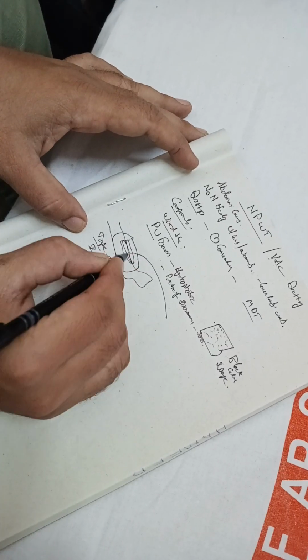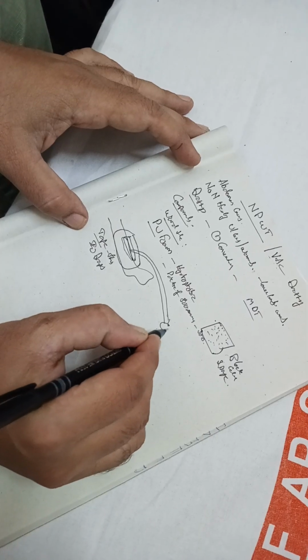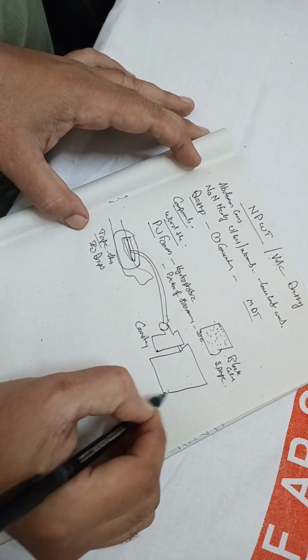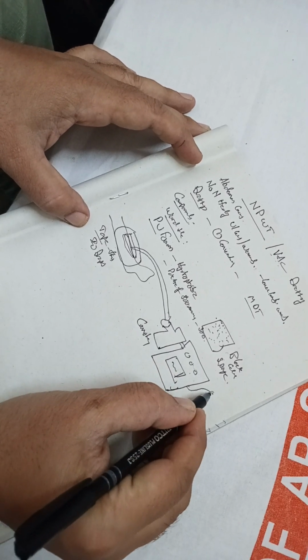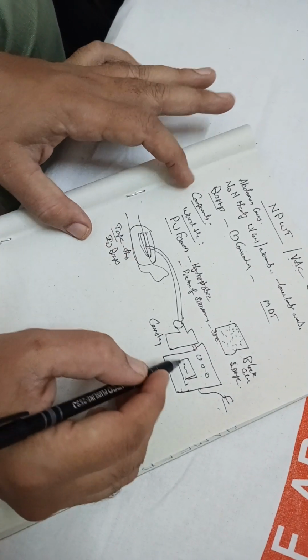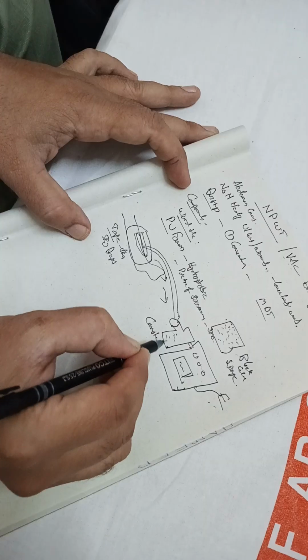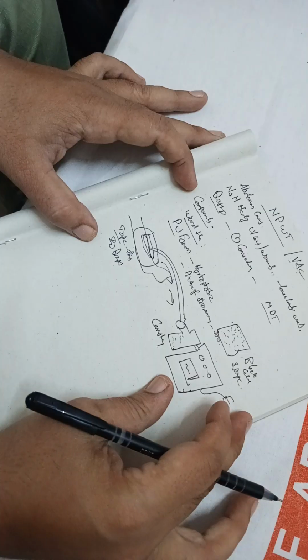Then there will be a connector, like a drain we connect. And this will go to a canister, and this will be connected to a machine with a display, and there will be buttons, and then this will go to the plug, electricity. So when you have done this circuit completely, then you switch on, it will start sucking, and whatever collection is there, it will be coming here. This will create the vacuum. This is the setup.